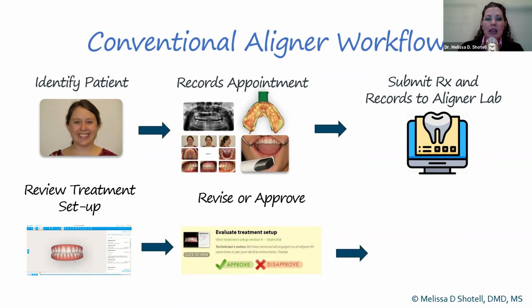Once the treatment setup has been approved, we then have to wait for the aligners to be fabricated and shipped to our office. So looking at our conventional aligner workflow, when we compare that to our in-office aligner workflow, we can see how we can save time and take more control of this process.